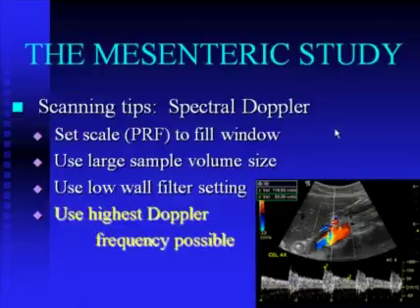In terms of spectral Doppler, again, you want as large a spectral Doppler signal as you can get, so set your scale so that your spectral Doppler display basically fills the space available. Use a large sample volume size. There's no reason to have a tiny, small sample volume.